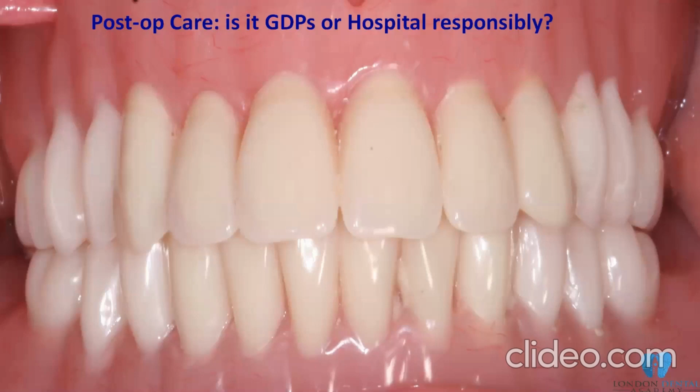And this is the overdenture finished. Again, as you mentioned, it's lovely in intercuspation. The interdigitation between the teeth is nice. If you look at all teeth from 6 to 6, all in action, apart from the anterior teeth in the ICP, RCP position, I will leave some space. So when you look from this corner, from that perspective, you will see a light coming through. So I don't want the teeth to be engaged 100%, but rather having at least 1 to 1.5 millimeter separation.